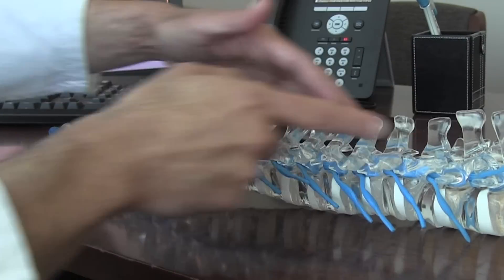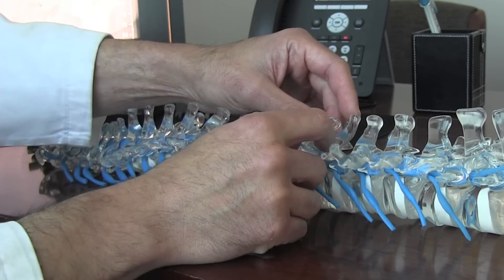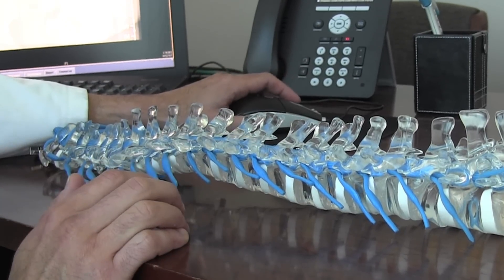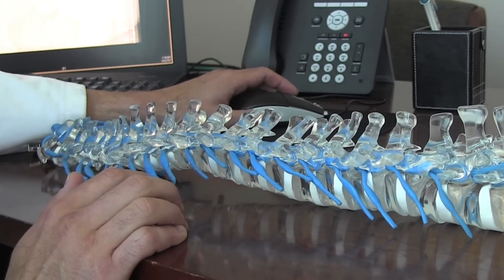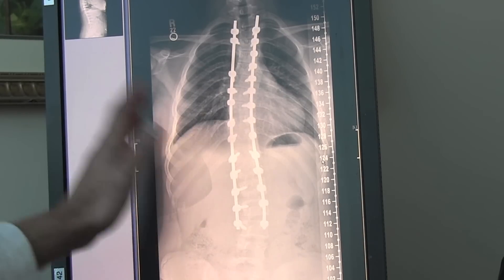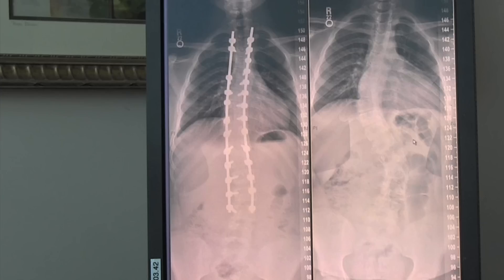There are rods going on either side of the spinous processes that the screws are connected to, to hold the correction. Let me show you what that X-ray looks like with the rods and screws in place. There are rods in the back holding the screws in a straight position — this is the side view showing the screws going from the back into the front, and the X-rays showing the rods holding the spine straight. Now let me put the two side by side so you can see what we were able to accomplish.